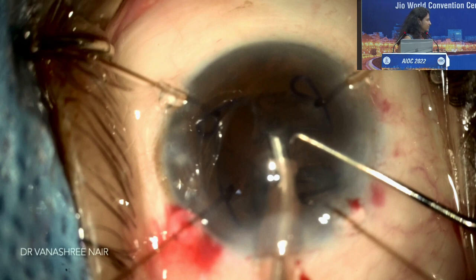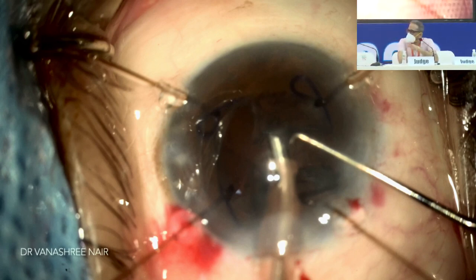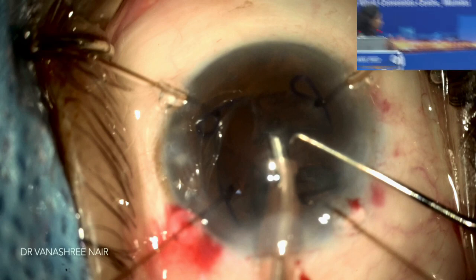Yeah, so that's actually again very important to keep the bottle height low. I would even go with the aspiration flow rate as low as I can keep it, maybe even 18 or something, whatever your machine allows, because that would cause less turbulence in your anterior chamber. Or you can put an IOL scaffold also, for that matter. Yes, for the last piece, if you are not confident about the bag fluttering, you can always put an IOL scaffold. Yeah, and you need to supplement it with OVD, absolutely, so that the bag will not come towards your phaco probe. Whenever there is a last piece remaining and I'm not confident, that's what I do. I just stop and fill in with the OVD.